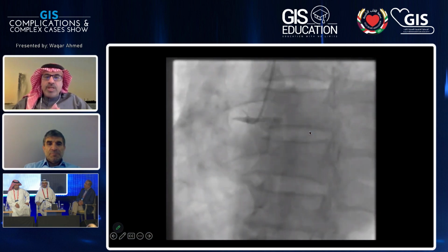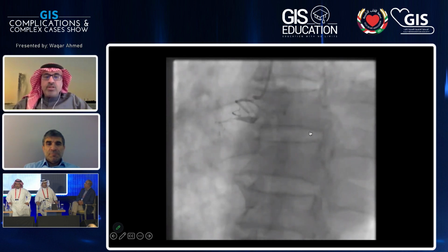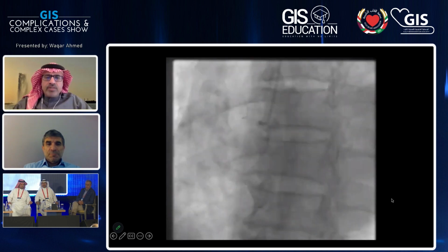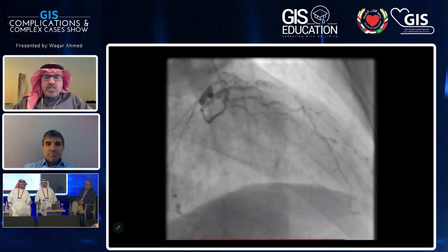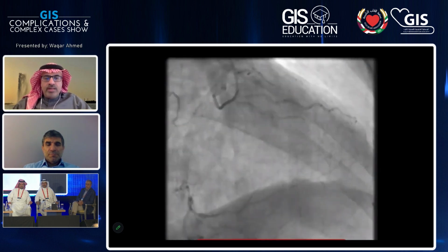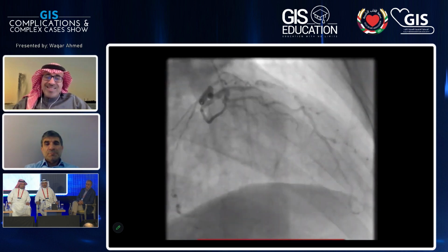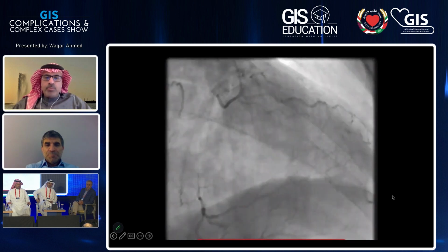So this patient obviously has a CTO of the right coronary artery. It's a long CTO. This is the diagnostic film. And he had significant disease in the LAD as well as the circumflex. And the entire right is filling here. So that's what gave him his SYNTAX 2 score of 42 and mortality of 18%.